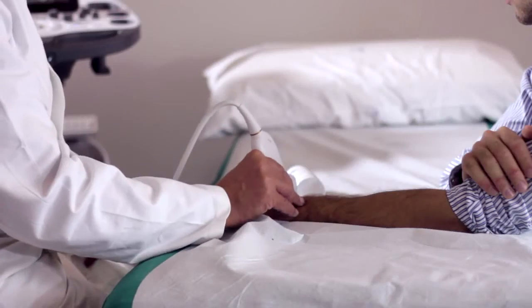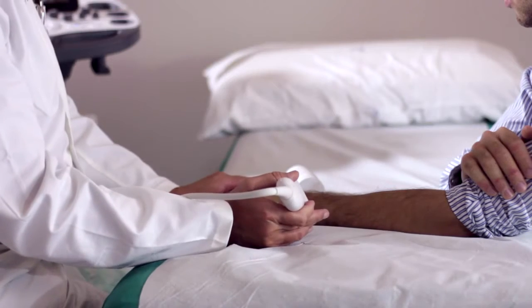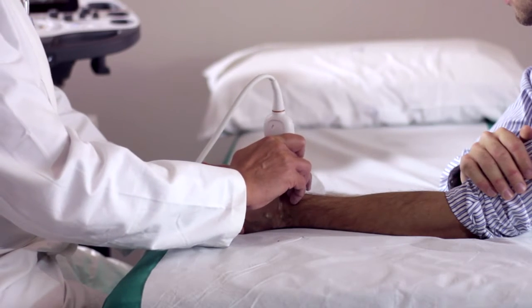This anatomy can be very well displayed with short axis scans. Of course, we can change direction and study the tendons also along the major axis. I would like to remind that it is possible to move the wrist slightly in this way to study the first compartment of the extensors, and similarly as regards the last compartment, the sixth.